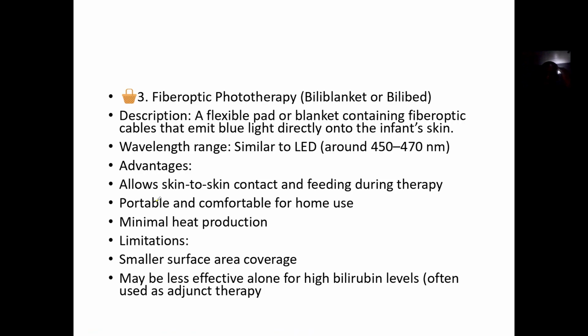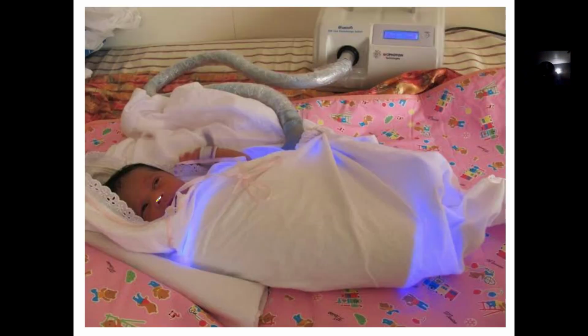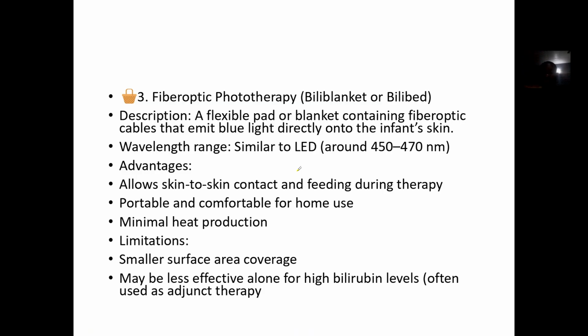Then the Biliblanket is fully called fiber optic phototherapy, using a Biliblanket or Bilibed. It can be a bed or a blanket. The blanket is specialized, and the blue light comes out from the blanket, so you just put the baby inside and wrap it. It's a flexible powered blanket containing fiber optic cables that emit blue light directly on the baby's skin. The wavelength is about 450 to 470 nanometers.